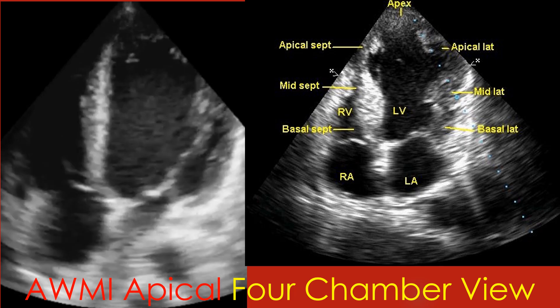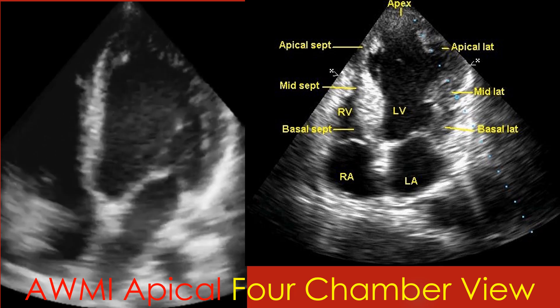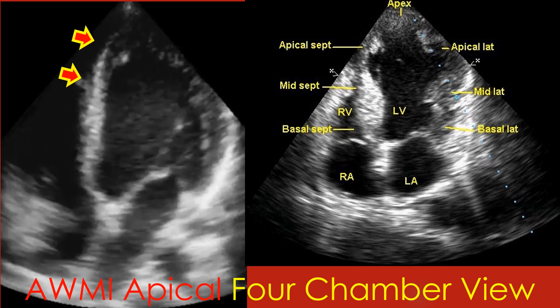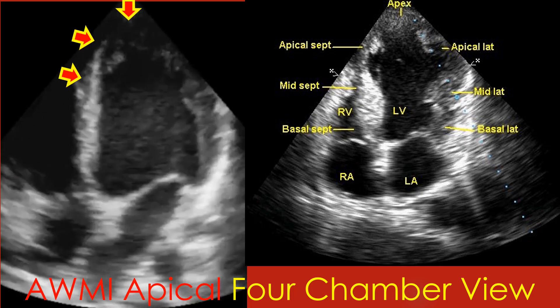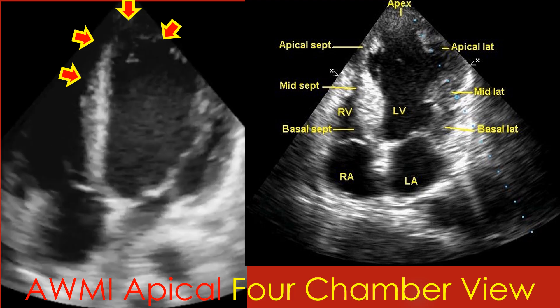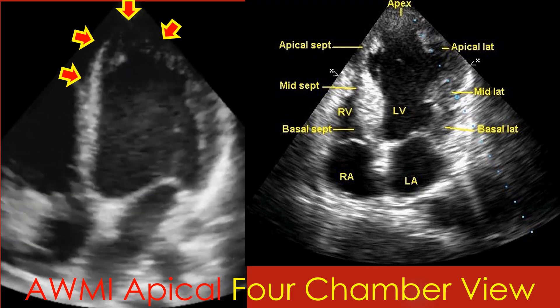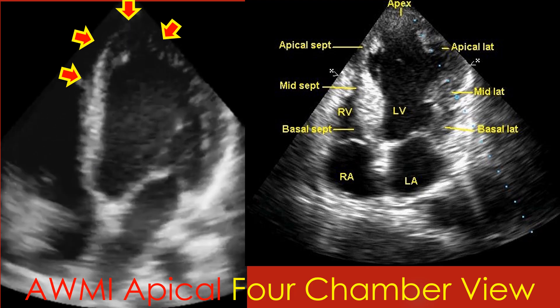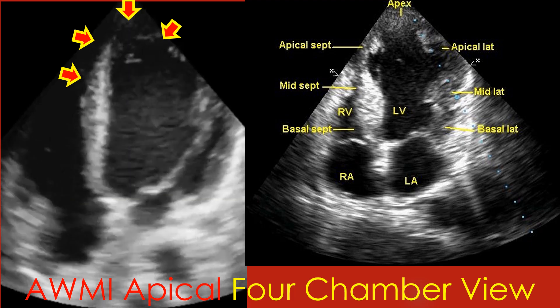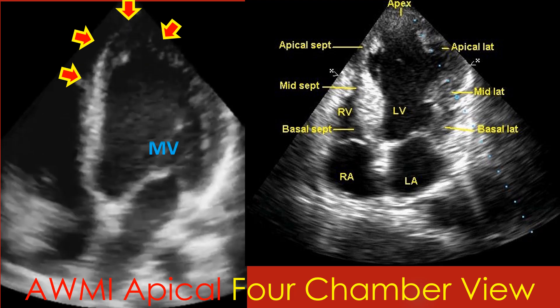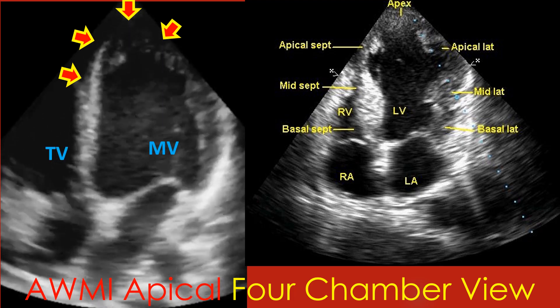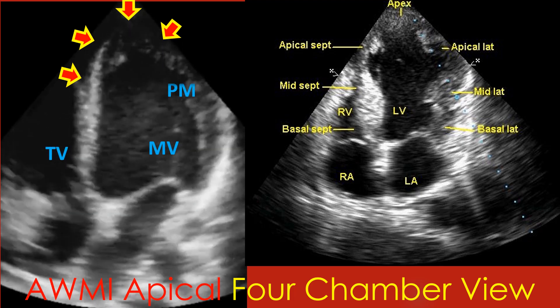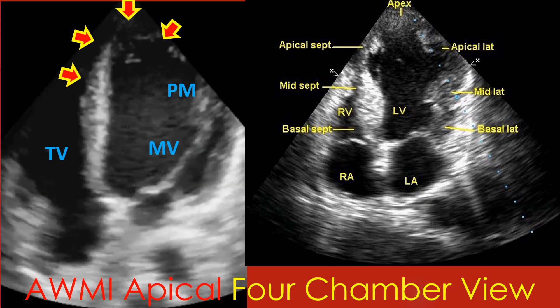Apical four chamber view showing hypokinesia of mid septal, apical septal, apical, and apical lateral segments. Other segments in this view are basal septal, mid lateral, and basal lateral. Mitral and tricuspid valves are seen well. Chordae tendinae and papillary muscle are also seen.